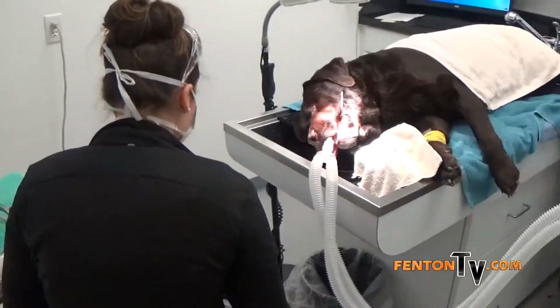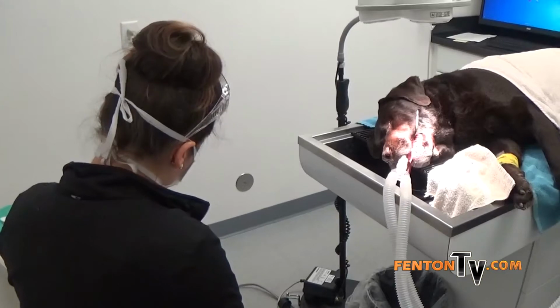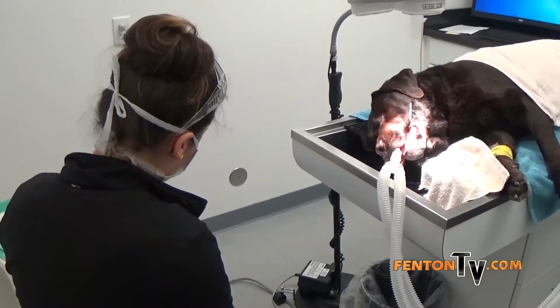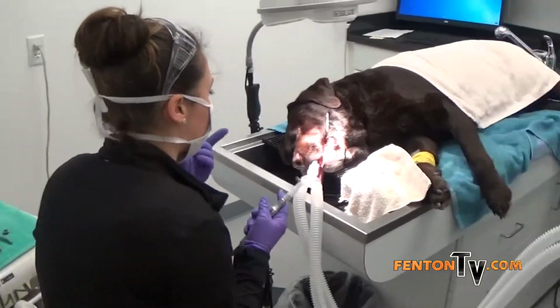Good, it's healthy. So I'm gonna polish to smooth out all those edges that scaling made, so bacteria doesn't have the opportunity to sit in there and collect.